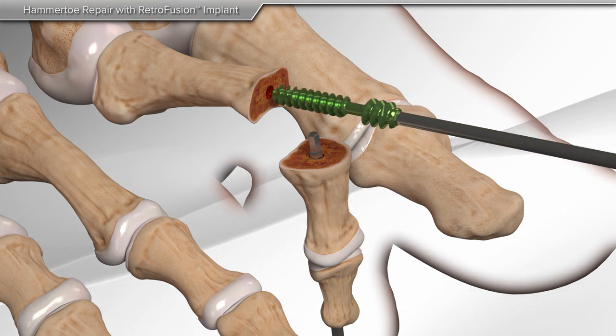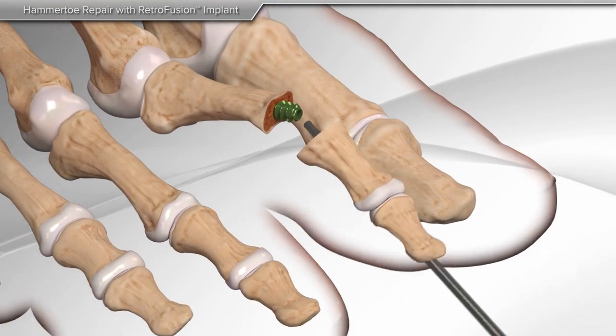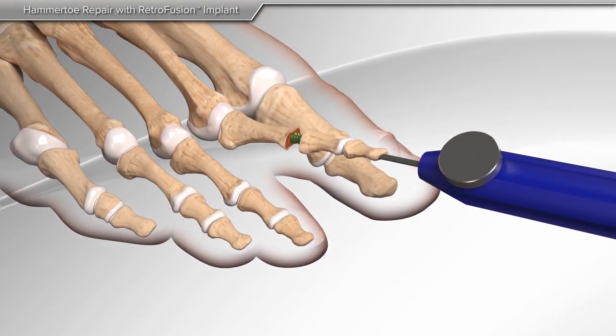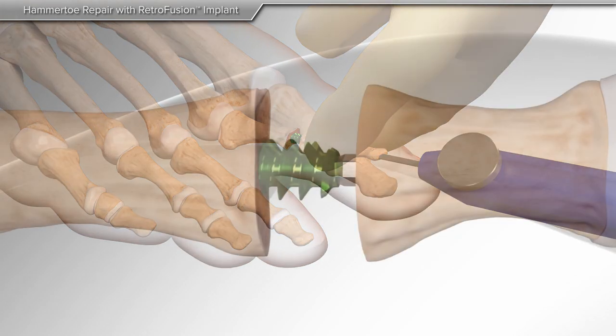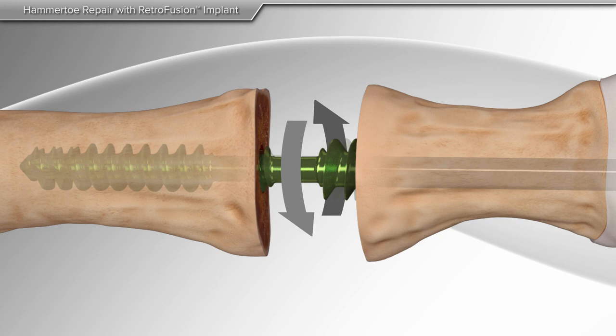The retrofusion screw is turned clockwise until the threads are flush with the bone. Next, your surgeon will hold the toe straight and the screwdriver is engaged into the screw. The screw is then turned counterclockwise until two-thirds of the screw threads are inside of the bone.